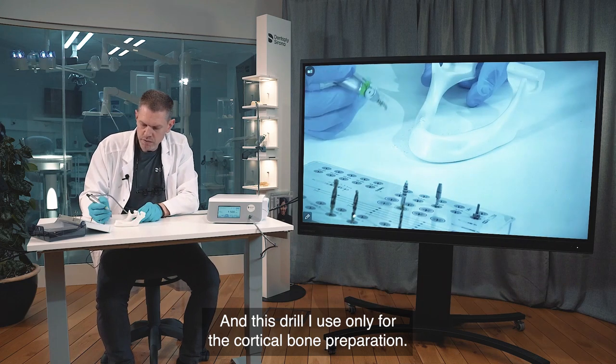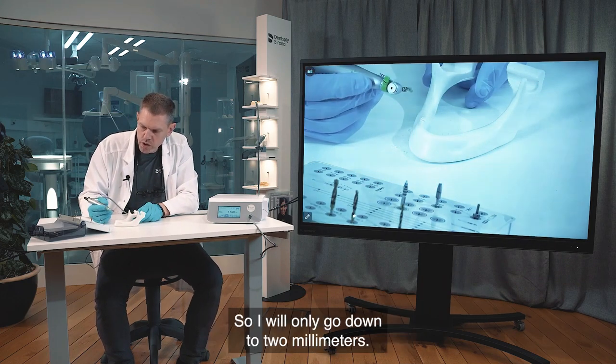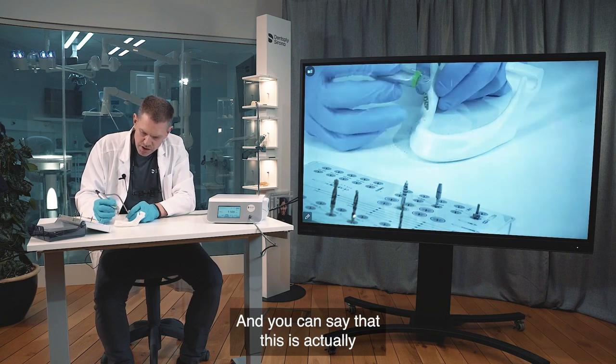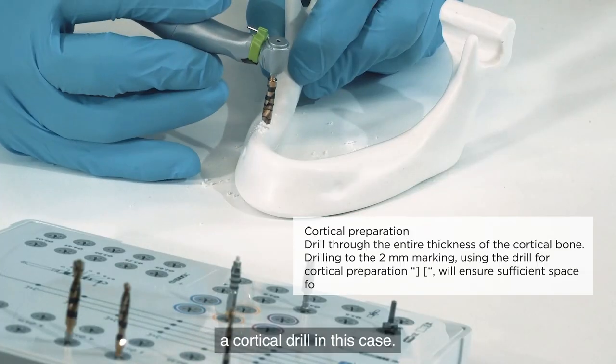Finally, drill number five. This drill is used only for cortical bone preparation, so I will only go down to two millimeters. You can consider this a cortical drill in this case.